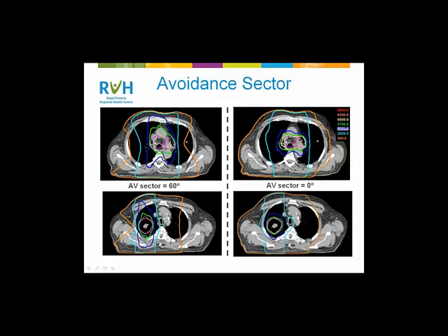Our physicians only use 6 MV on lung cases. Do you have any documentation or data that above 6 MV is okay? Yes, we do. There are studies that have been done on the accuracy of dose calculation using 18 MV. It was historically a problem because our dose calculation algorithms prior to 3D superposition were very inaccurate. So the tendency was to stay away from 18 MV because there's a lot of dose going on that the computer is not showing us. That is still there to some degree, but it's largely limited to the use of small fields with 18 MV in lung. So if you were doing your modulation with 18 MV, that would definitely be a concern in terms of how accurate the dose displayed to me is.